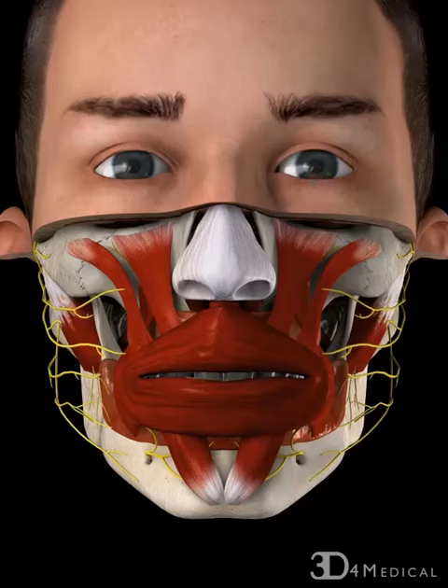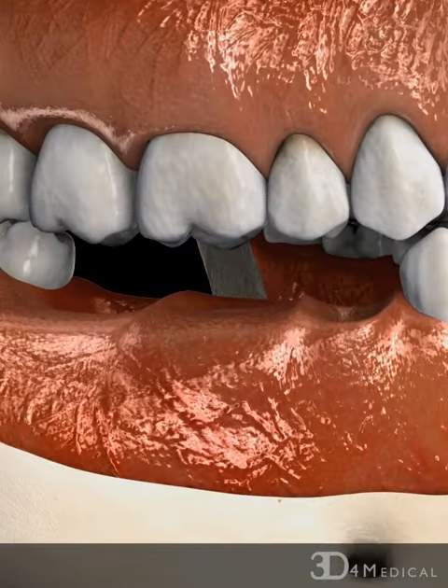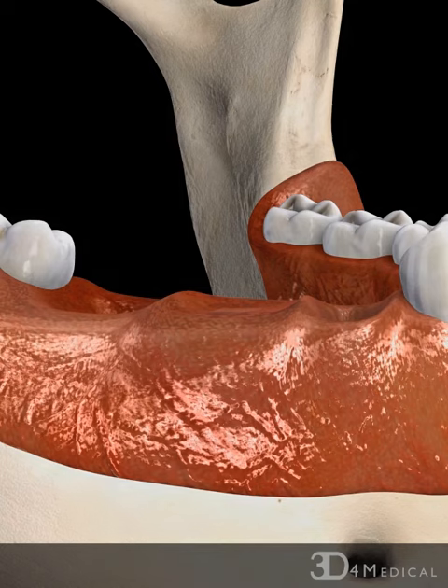A number of adjacent missing teeth can be replaced using an implant-supported bridge. Initially, a surgical incision exposes the bone underneath the gum and the bone is prepared using a number of drills to create a socket, which is the correct size for the implant.